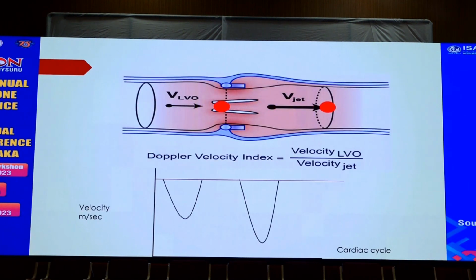There are many times we may not be able to measure the LVOT area properly. That always becomes a problem. That's when the dimensionless index comes in, where we try to take the LVOT area out of the equation. The concept is simple. When blood flows through a prosthetic valve, the velocity increases. The increase in velocity is directly proportional to the stenosis, or narrowness, of the valve. Normally, the velocity ratio between the LVOT velocity and the prosthetic valve velocity is more than 0.3. If the velocity in the prosthetic valve is too high, the ratio decreases.